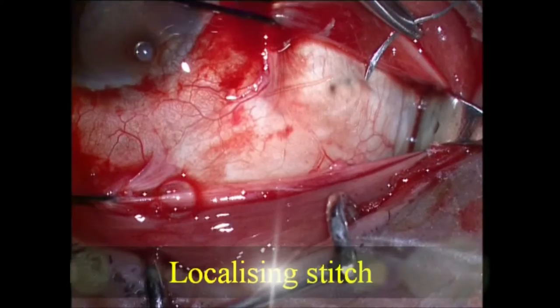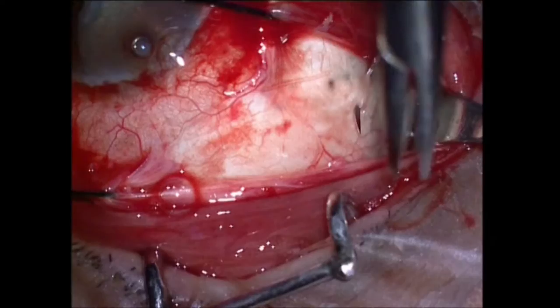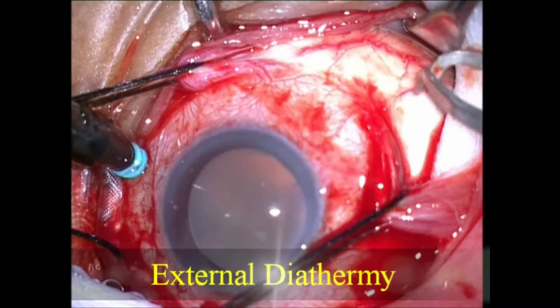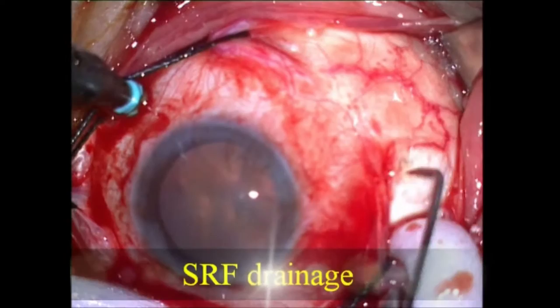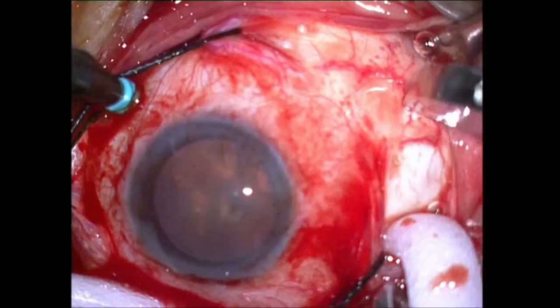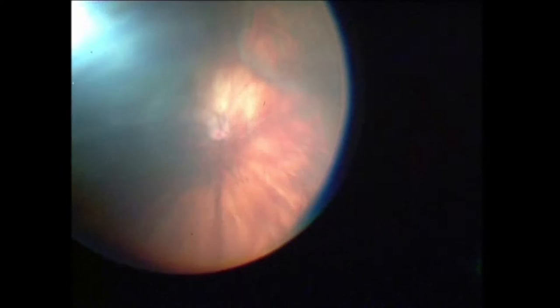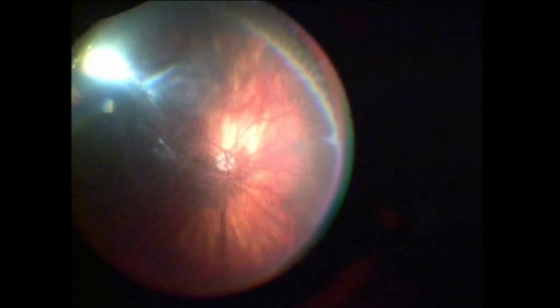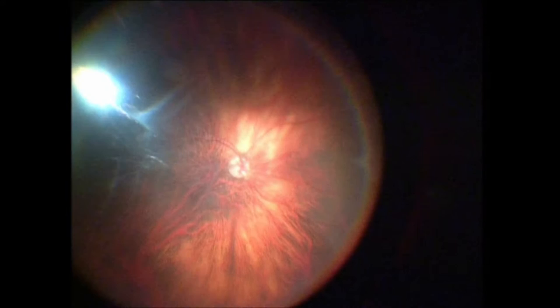External localization of the break is done and sutures are taken to pass the plomb. Sub-retinal fluid drainage is planned and external diathermy is applied at the proposed site. SRF is gradually drained by giving gentle pressure posteriorly. The fundus is checked to assure complete drainage and to rule out any bleeding, and the overall periphery is checked.